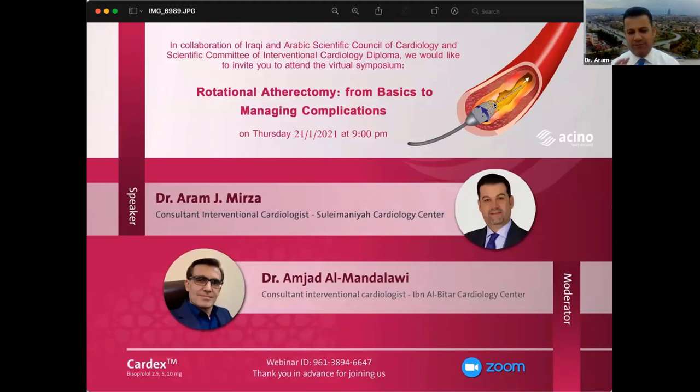It's very difficult to do rotablation for the ostium of the left main stem, because if you are not very cautious, you might dissect the whole left main stem. The trick there is that you should prepare yourself, the IR team, for some unwanted complication. And the most important thing is that you shouldn't engage the guide catheter, and you shouldn't be too far away from the ostium, because you should debulk or do plaque modification for the ostium, otherwise you cannot put a stent.